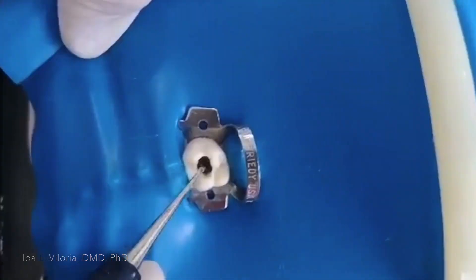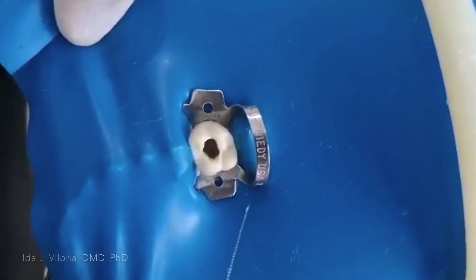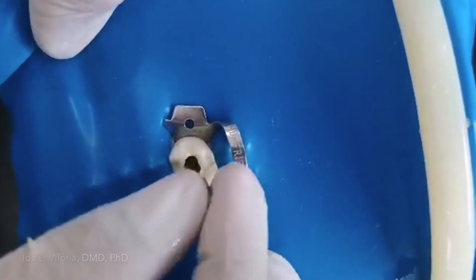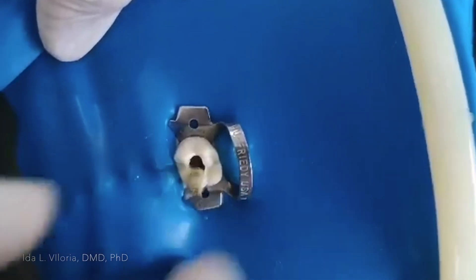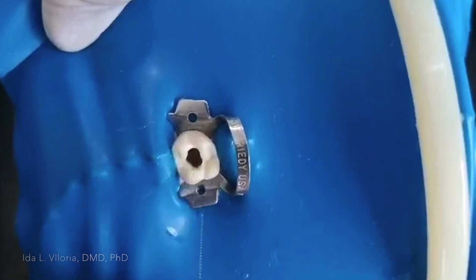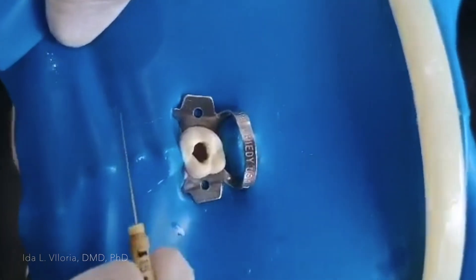Using the Endo Explorer, and then after that, you use your size 15 file — you can go in. One canal, another canal, and the palatal canal. That's it. This is the maxillary first molar access cavity preparation. Thank you.